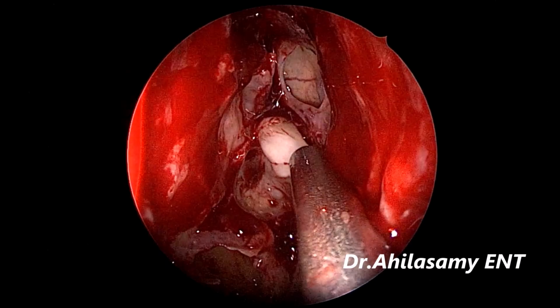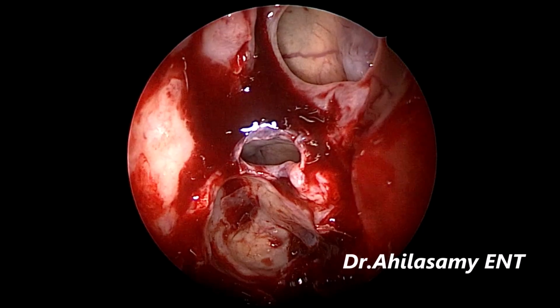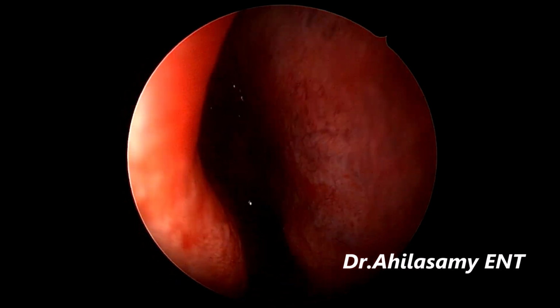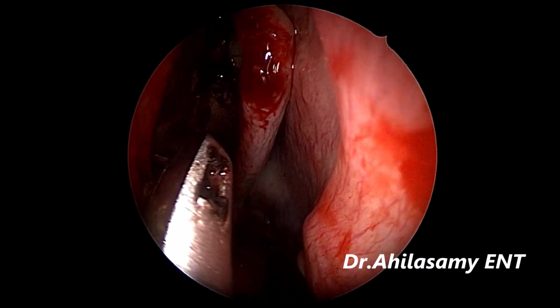We don't pack the nasal cavity after routine nasal surgeries or FESS surgeries. No need at all. Suppose there is an Onodi cell, which I will take out. Some bony chips I am taking out with the Blakesley forceps.